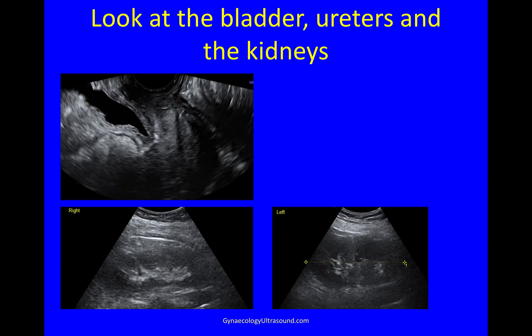Last but not least, you need to check the bladder, the ureters and the kidneys. I'll do that in a different video. The kidney views are done transabdominally.